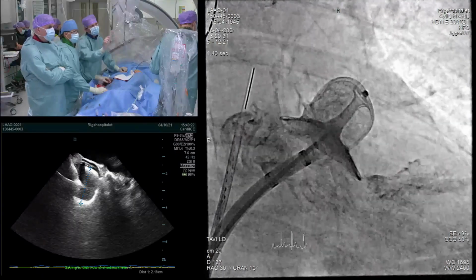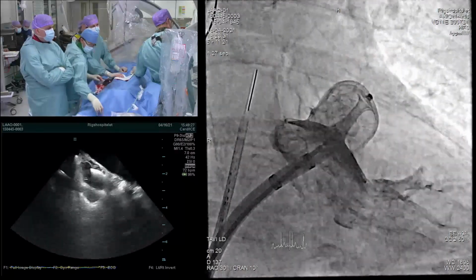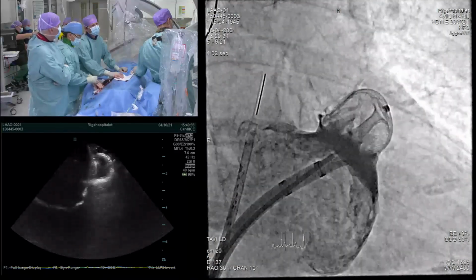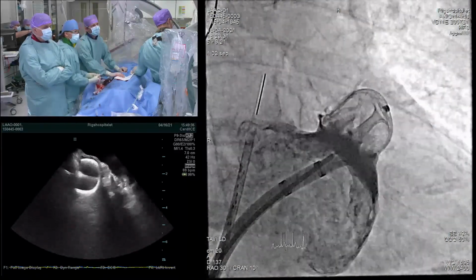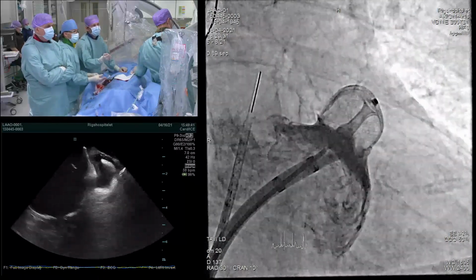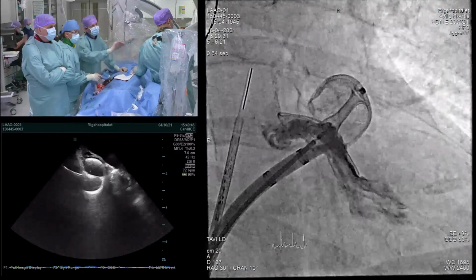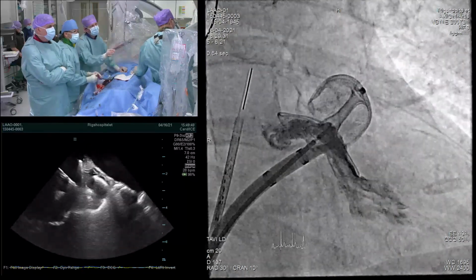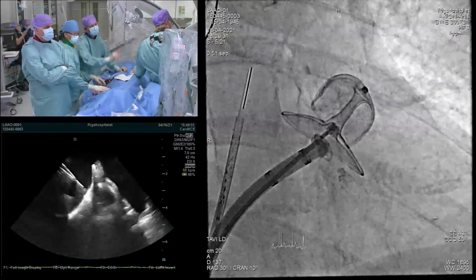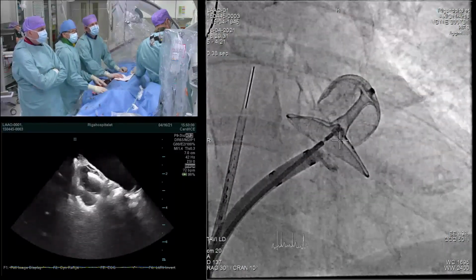You also want to have it nicely aligned with the central axis of the LAA, which is the case, and that's almost always the case with this device because it's a self-centering device. And then what I really find reassuring here is that there is some separation between the lobe, the cup and the disc. So that means there is probably enough anchoring in this cup. And then last one, and that's actually the whole purpose why you do this, you want to see the disc restoring the concavity of the left atrium very nicely, a nice concavity, a small pull into that LA. That's the best guarantee of a complete closure of that LAA.